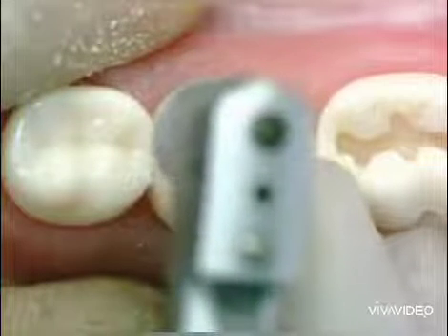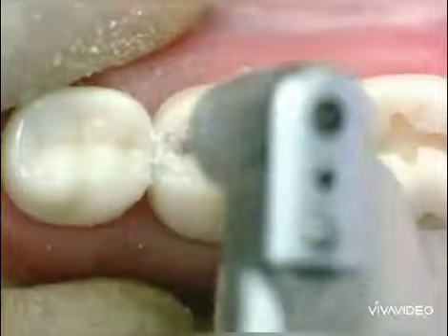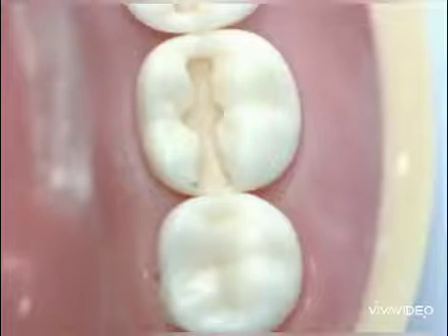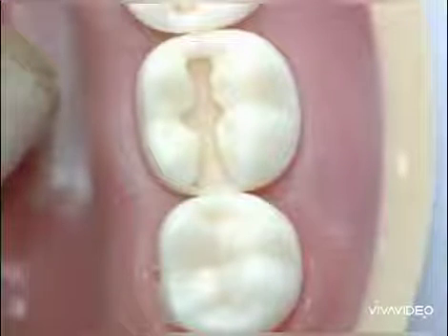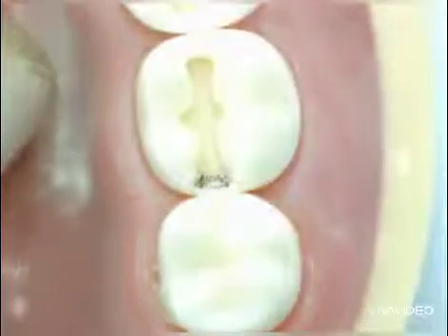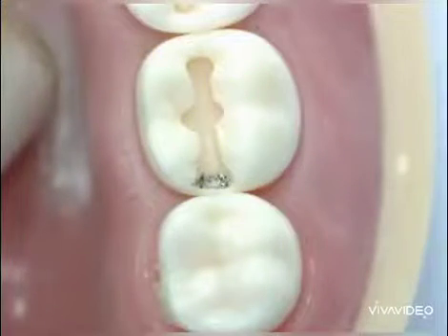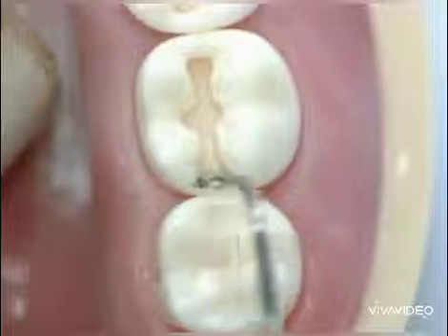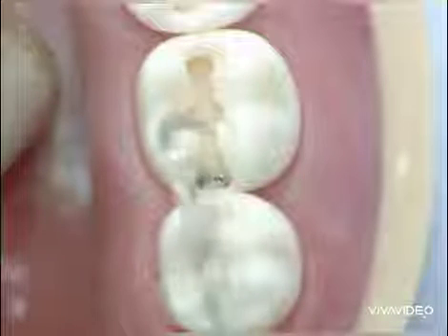Extend the preparation of the occlusal Class 1 to the proximal area and extend the proximal area.